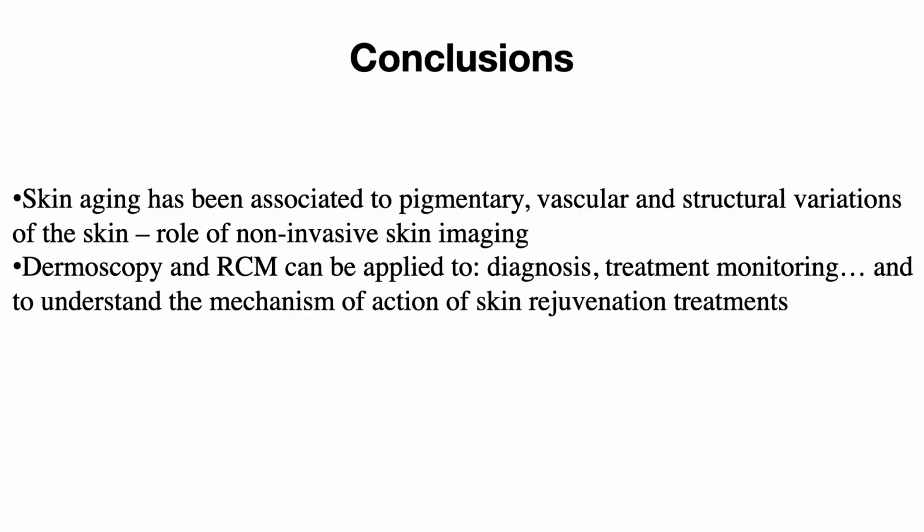into practice in dermatology, which can vary and not just include, of course, skin cancer, but also understanding how the skin varies with passing years and after exposure to the sun, which is one of the major factors damaging our skin. And of course, we now understand how we can actually study the mechanisms of action of skin rejuvenation treatments thanks to the use of these tools in our practice.